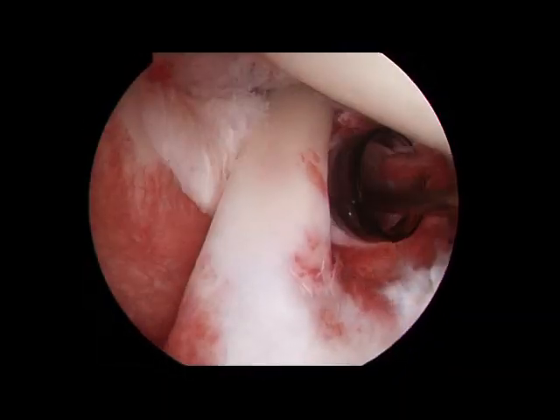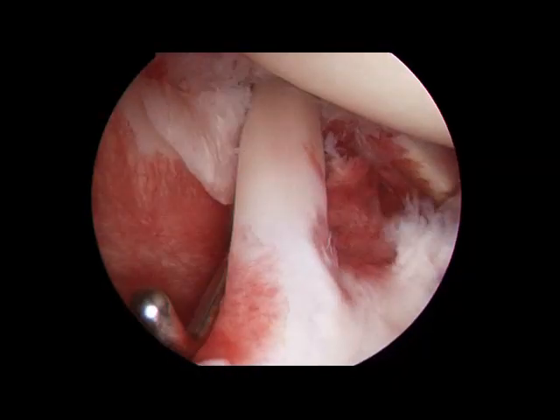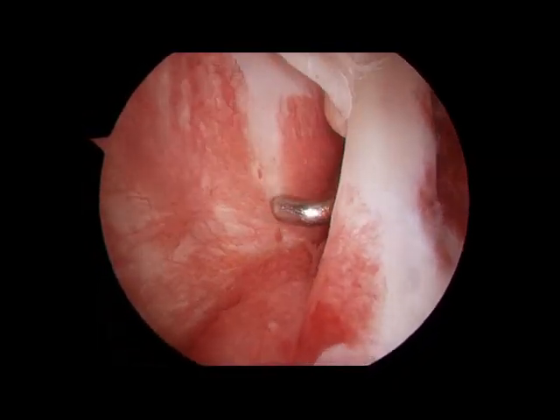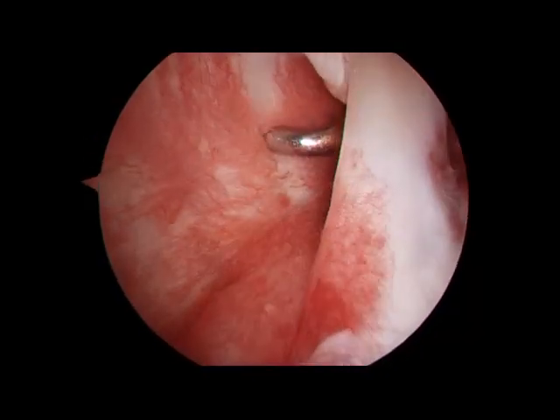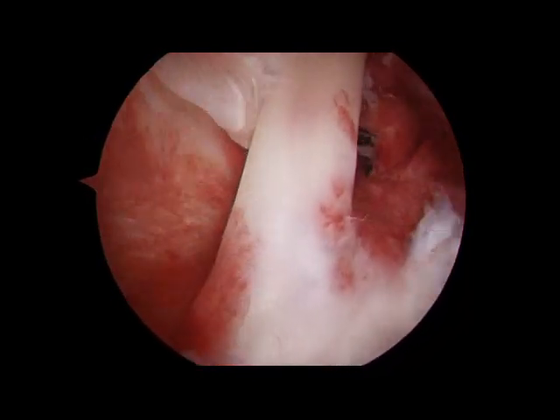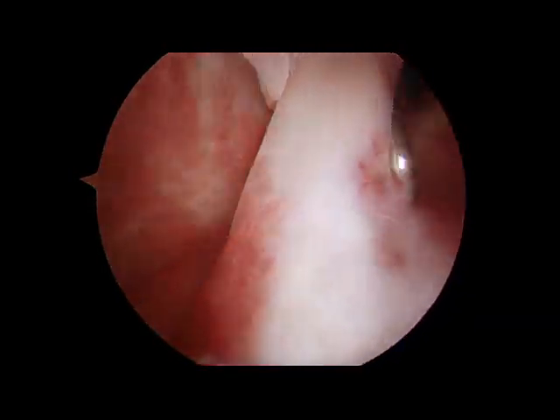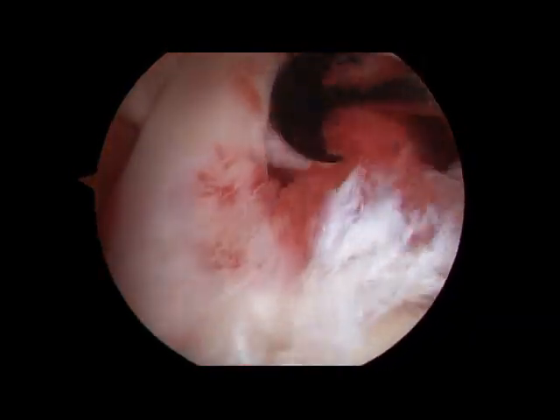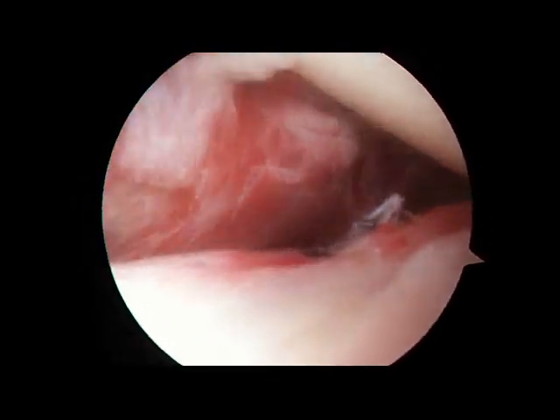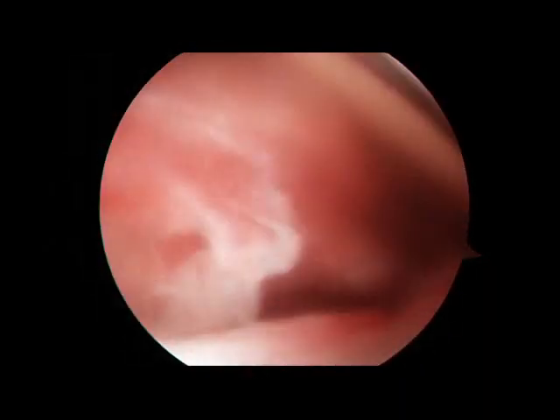Now we place the camera in the shoulder and look. One of the major things you see is that this shoulder is very synovitic — you can see all this redness right here, so it's been irritated quite a bit. You can see all the blanching of the blood vessels, so it's very hyperemic. You do have a rent in the tissue from the manipulation.